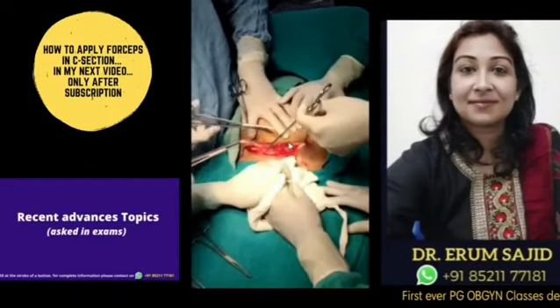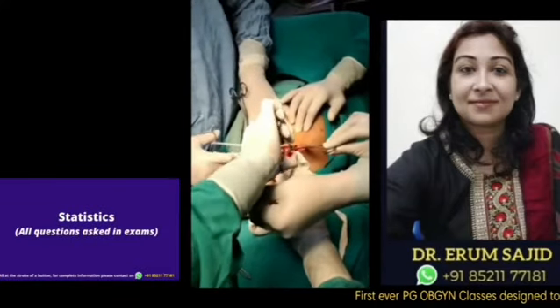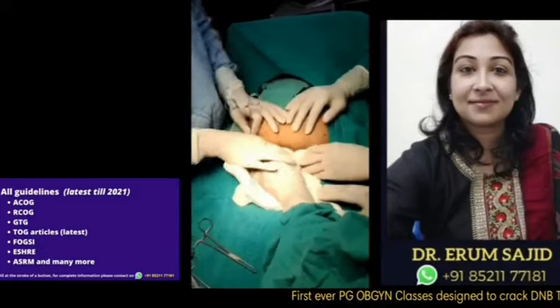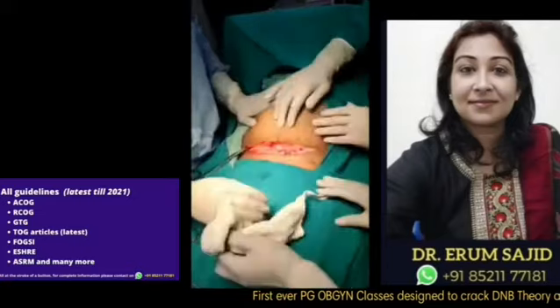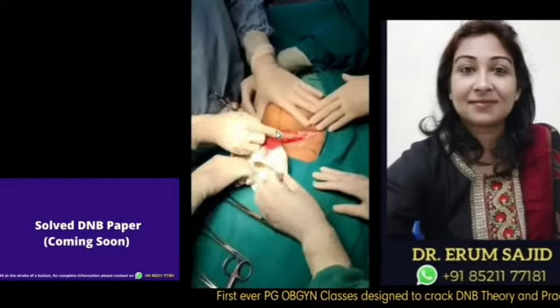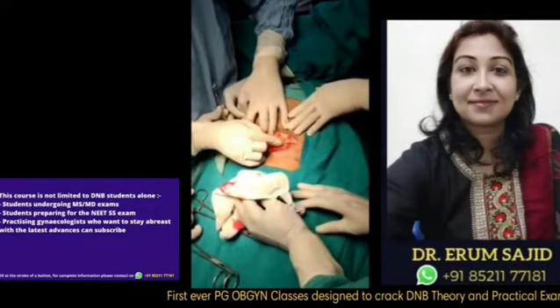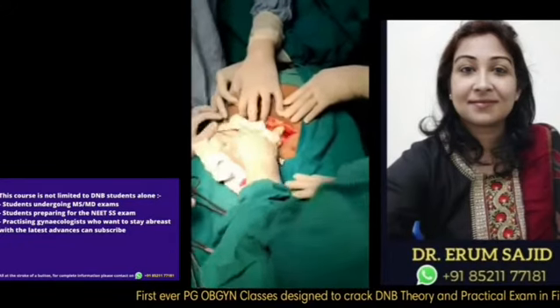The bleeding points that you can see over here, I'm asking my assistant to not dab dry, but to press upon them. All these little oozers, if you press properly, will quieten down with pressure. Now have a look at my hand here. I'm stretching the skin so that I don't give a puckered skin incision or puckered internal incisions. They are all bold, straight, proper incisions. See my hand movement: no shaking, no tilting, nothing.